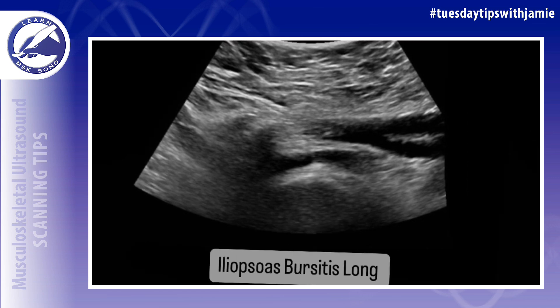The bursa is a flattened sac of fibrous connective tissue lined with synovial membrane. It is typically collapsed unless bursitis is present, like in the examples I've shown.